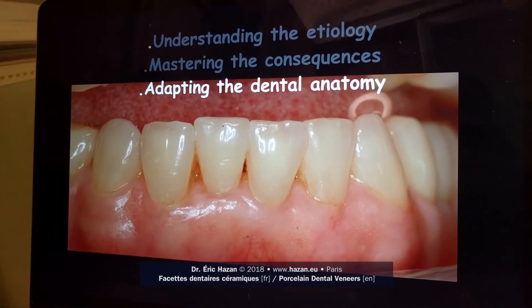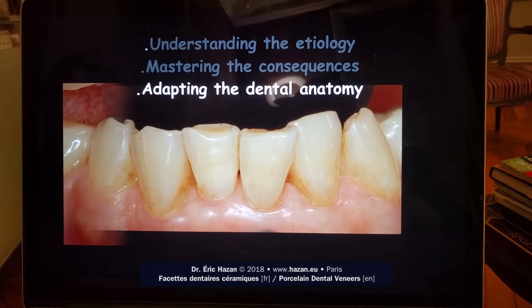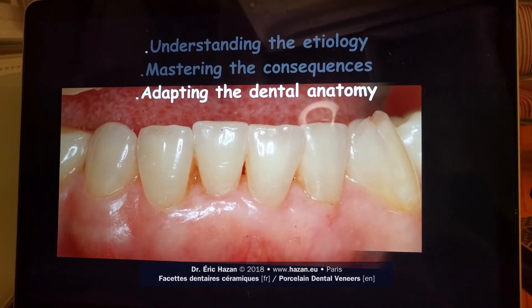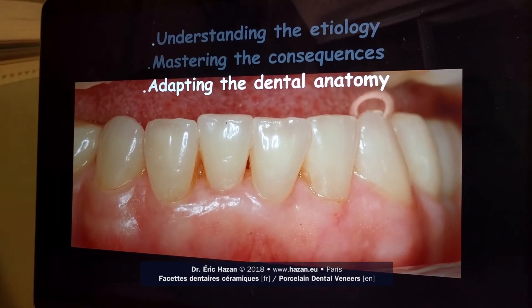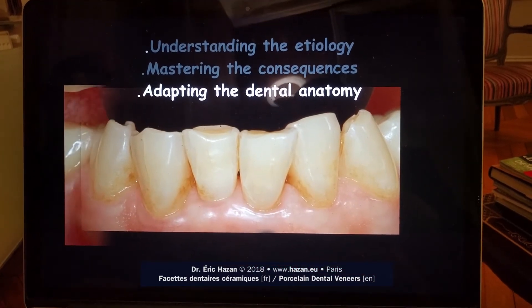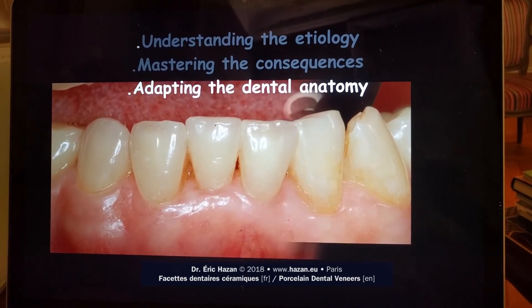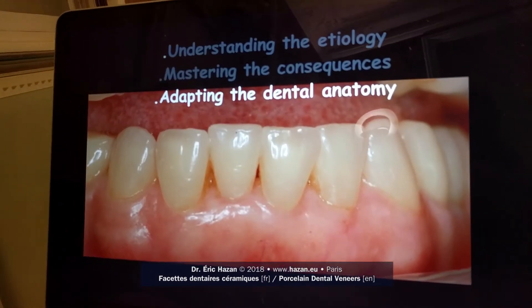The main problem in this case is to restore the function by restoring the teeth in a way that gives back to the teeth the strength and the possibility to function the same way — or very close to the way they were functioning prior to these deformations. To do this, we are going to adapt the dental anatomy.